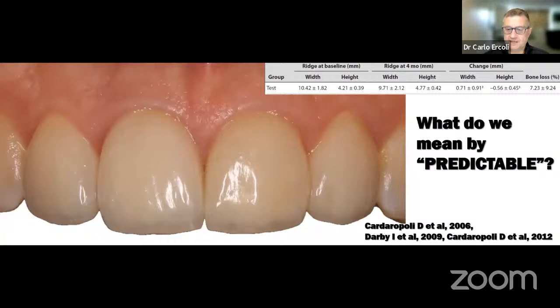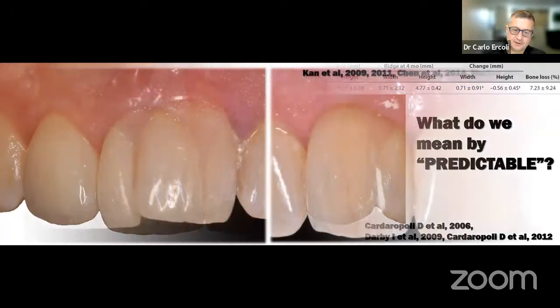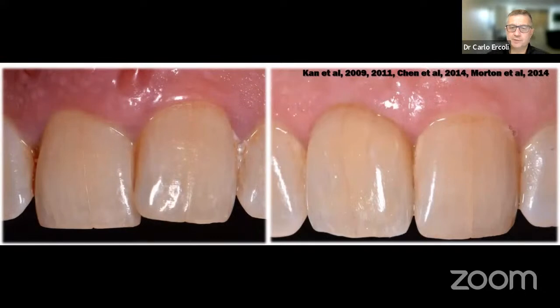Now, if you look, however, at the anterior area, remember we saw this case where there was an implant on area 1-1. And generally we say that, if we place an implant immediately and we maintain the soft tissue, things are predictable. But now, what do we mean by predictable? If you place an immediate implant, more often than not, you need to anticipate a little bit of buccal recession. If you look at the picture on the left side and compare to the right side, it's the same patient, but tooth 1-1 has been replaced with an implant. We're looking at microscopic detail that often the patients might not even be able to realize, but sometimes they do. So you have a little bit of a recession again around tooth 1-1.